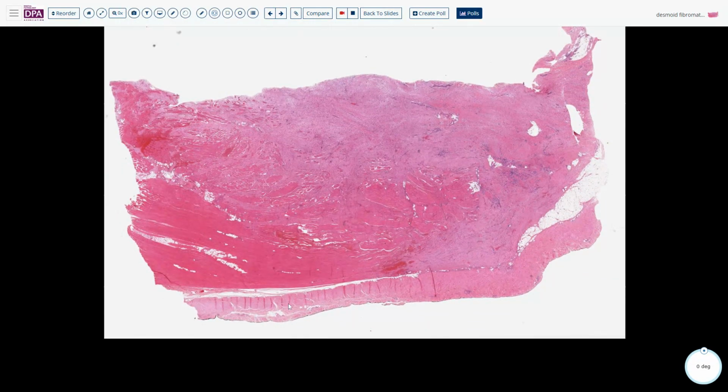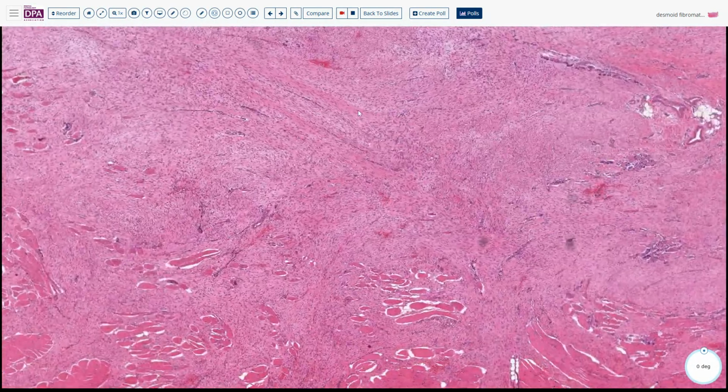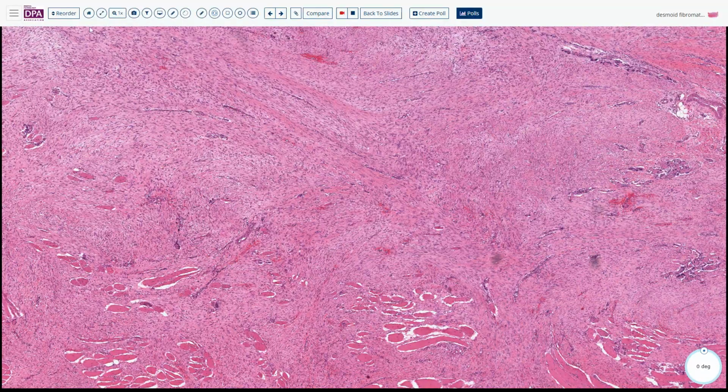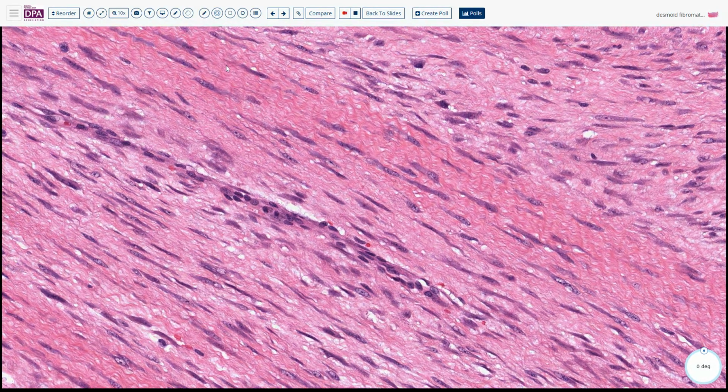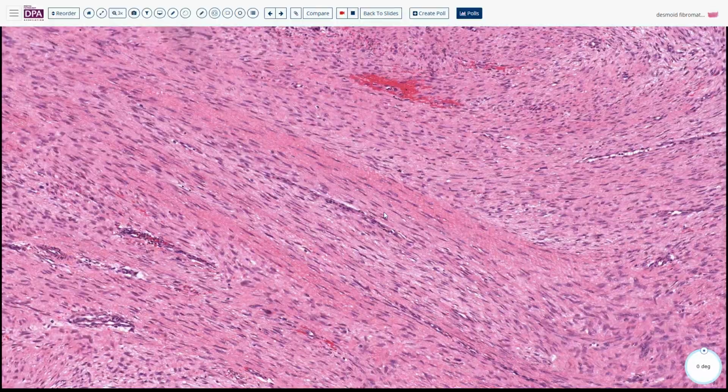We can see this is the really deep fascia and muscle cells. Then we can see some spindle cell proliferation forming really long fascicles. Even at this scanning magnification, we can see the fascicles are really long. At high power, some cells show open chromatin with conspicuous nucleoli, so before this would be in the category of myofibroblast. But in between these cells there is also wavy collagen deposition, so some of these darker cells should be fibroblasts. This is a characteristic feature of this tumor.